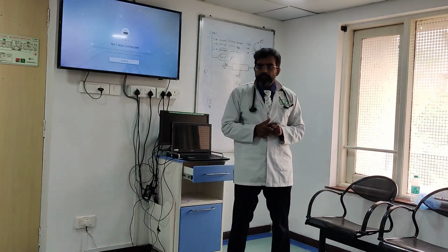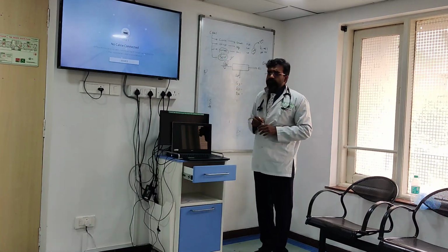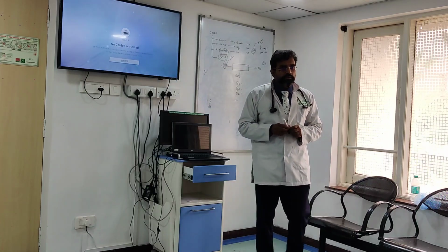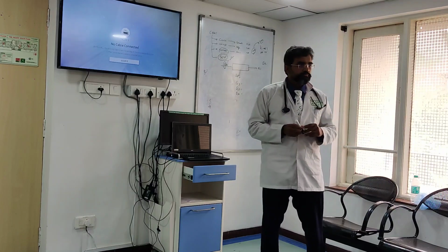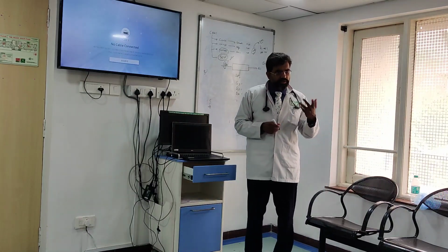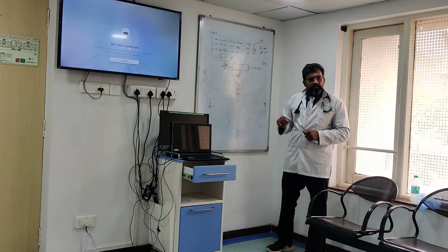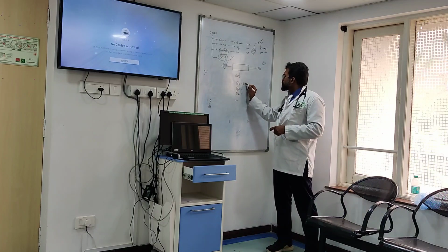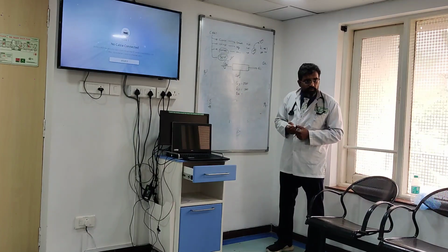Now what will you do? Severe myoglobinuria. Which modality will you use? CVVH, CVVHD, CVVHDF, and why? Myoglobin is what size molecule? So what do I want to use more? Convection. You understand? So I want to use convection more. In this case, maybe I will increase my convection dose. So replacement fluid I will increase. Maybe I'll make the replacement 2000 and I'll keep my dialysate as 1000 or 800 or whatever lower I want.